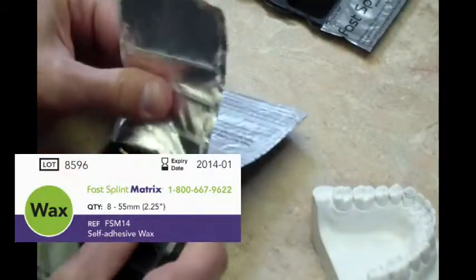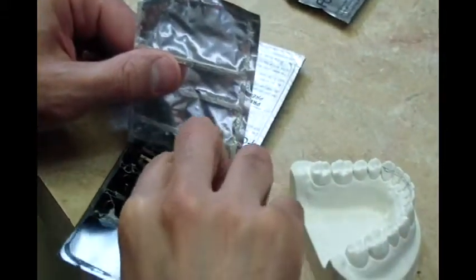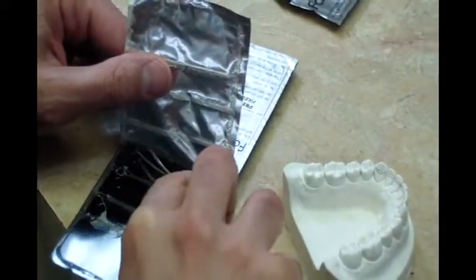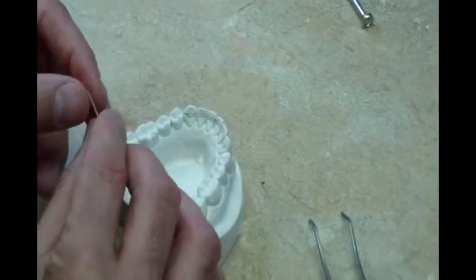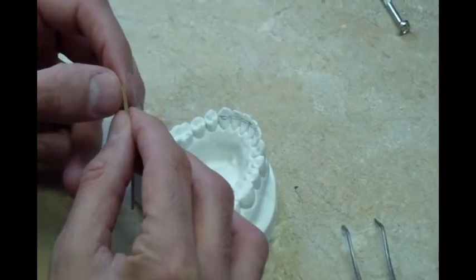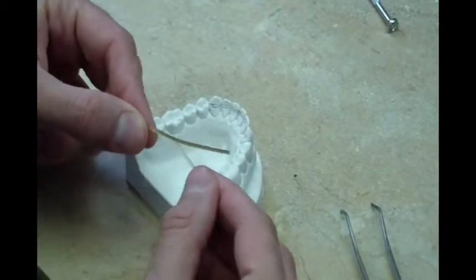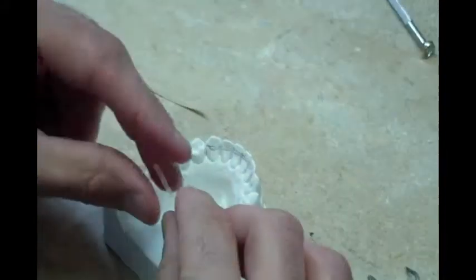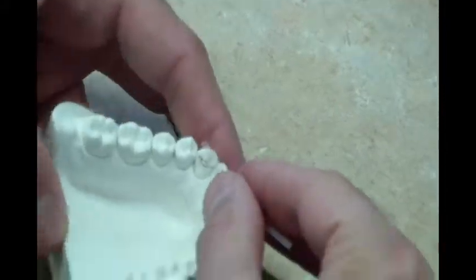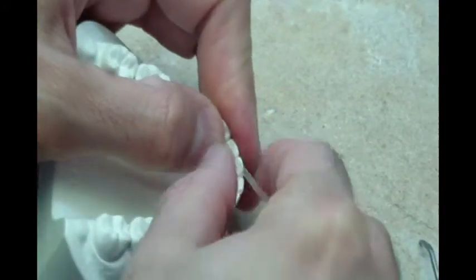Remove a strip of FastSplintMatrix Wax from the package and peel off the protective strip, exposing the adhesive side of the wax. Starting from one side of the retainer position, place the wax strip across the lingual teeth surfaces, starting just short of the distal contact point, ensuring that the adhesive side of the wax is facing the tooth surface.